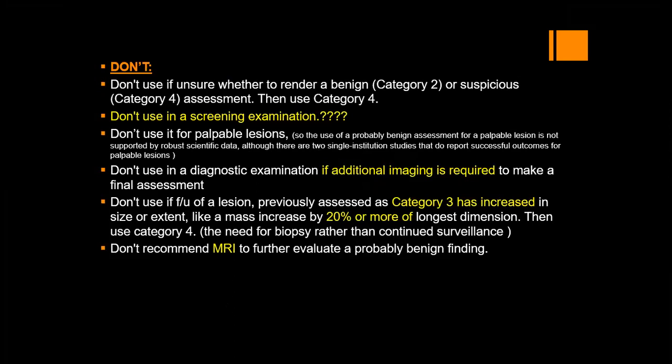Okay, so use of a probably benign assessment for a palpable lesion is not supported by proper scientific data. However, other institutions still use BIRADS 3 for those palpable abnormalities if they demonstrate full criteria of being probably benign.